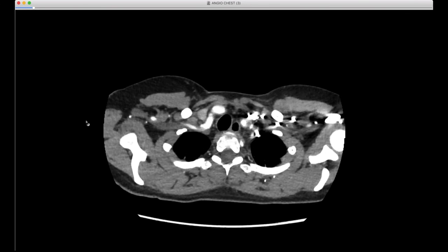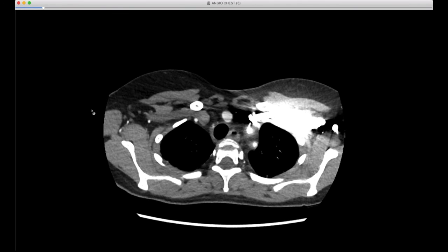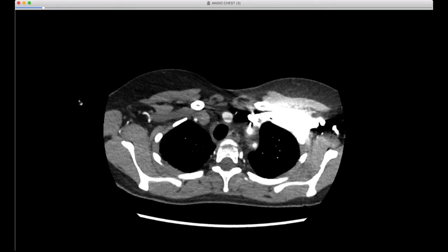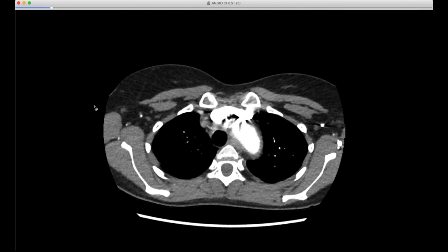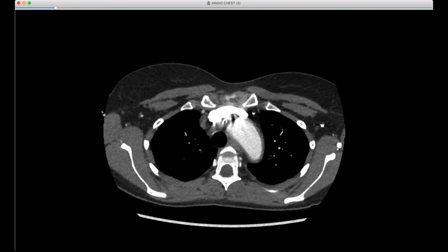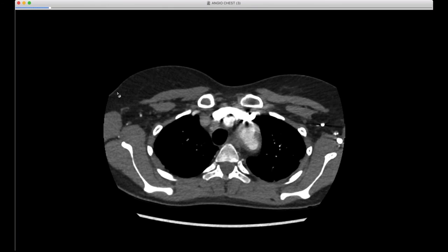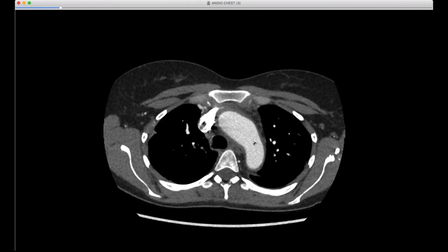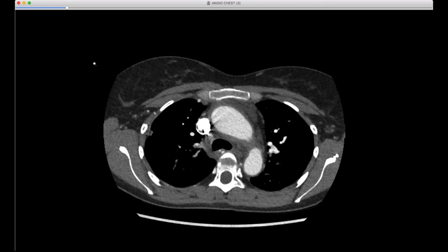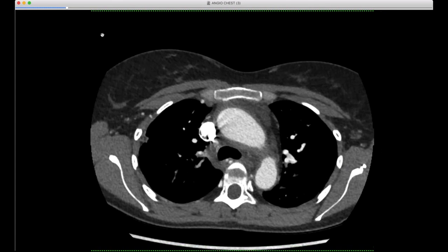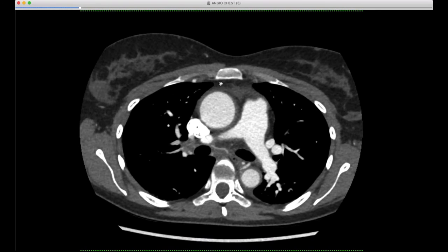Here's another great case that Art Stillman also showed me. We have this young patient who is 28 years old, a young female. She came in with some abdominal pain and has a known history. You can already see that up here, the arch vessels have this soft tissue around them. The aortic arch, ascending and descending aorta all have this circumferential soft tissue thickening around the aortic wall. Coming down, you can start to see that the pulmonary arteries have some stenosis.